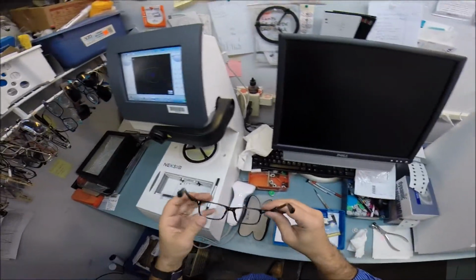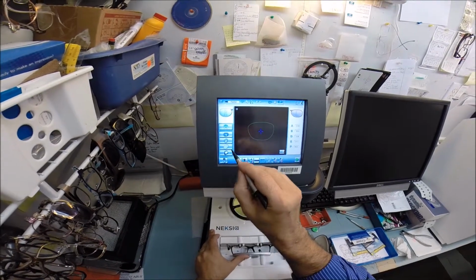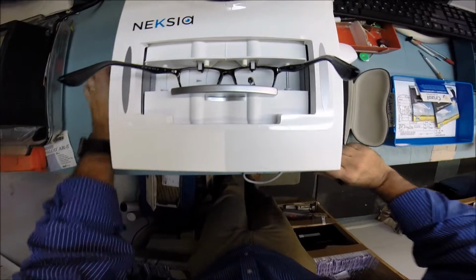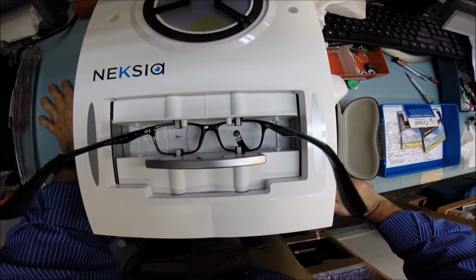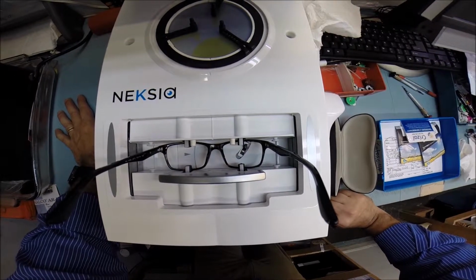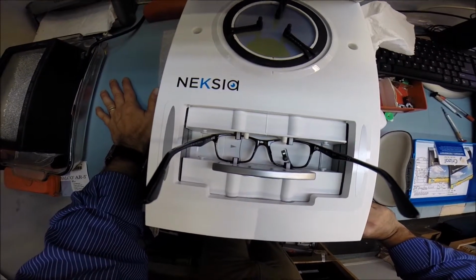So now that is done, I'm going to put your frame into my tracer and hit trace. Well, I got to hit the green arrow first. But then the next thing that happens is the stylus will pop up and it's going to trace the shape of the right side of your lens, the lens shape, before moving over and tracing the left.